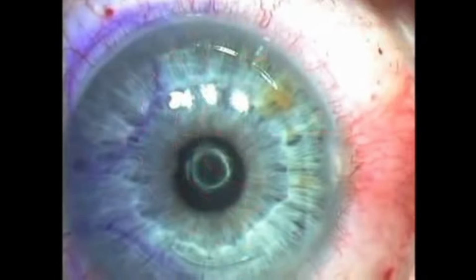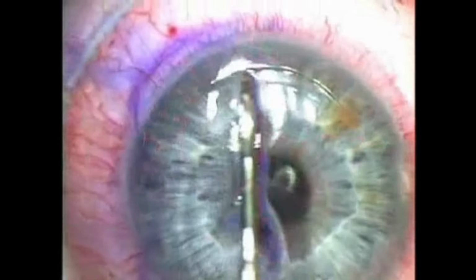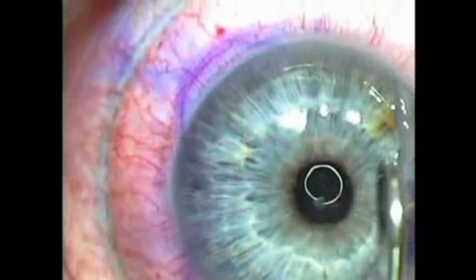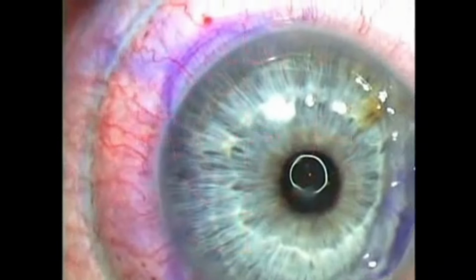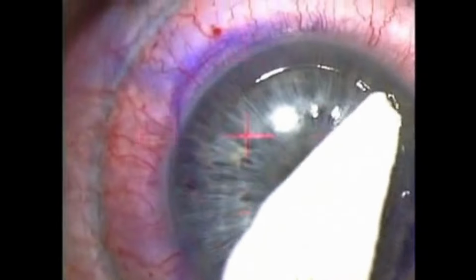As you can see, the flap is quite elegant, and now it's up to the surgeon to be gentle to the epithelium to cause minimal devitalization. A blunt spatula is used to accordion the epithelium back upon itself as atraumatically as possible. The surgeon, if he wishes, can check the corneal thickness remaining, and this epithelial flap was known to be just over 50 microns thick.